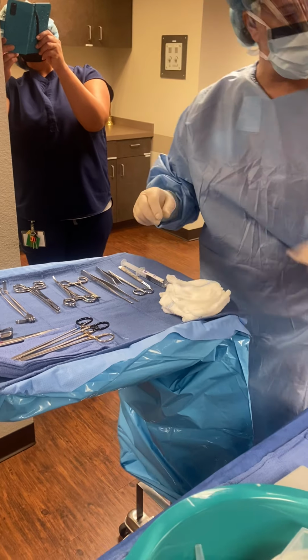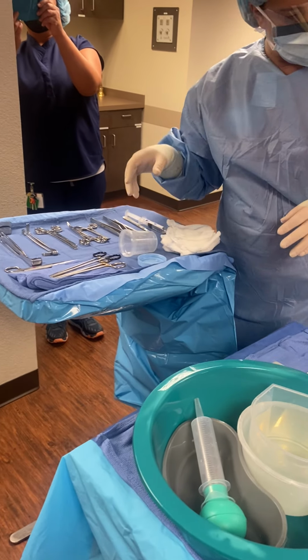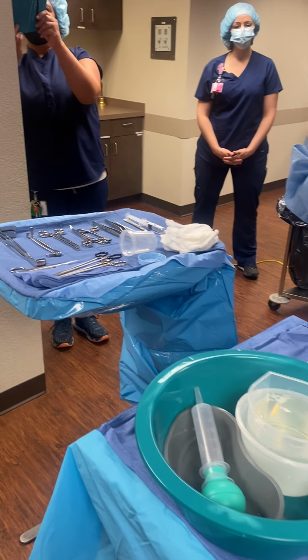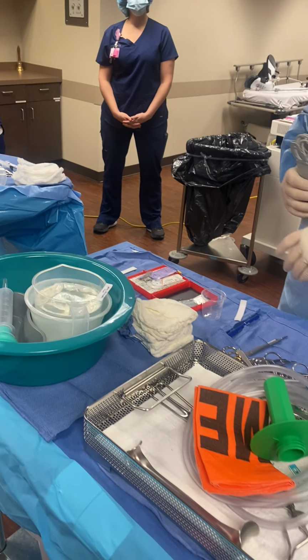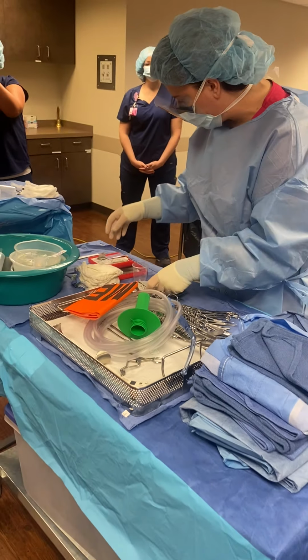So keep them there. I'm going to bring up my cup to put my biopsy in, so I'm ready for that. Did I miss anything? Okay, oh, I'm going to load my suture. I'm going to show you guys how to do that really quickly.